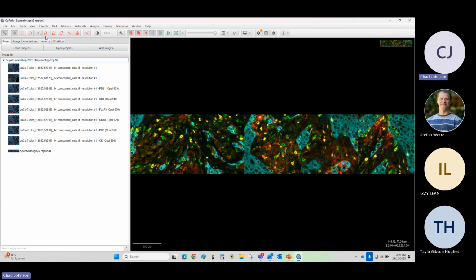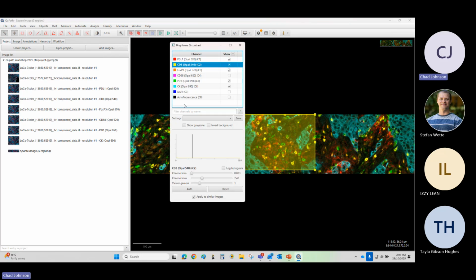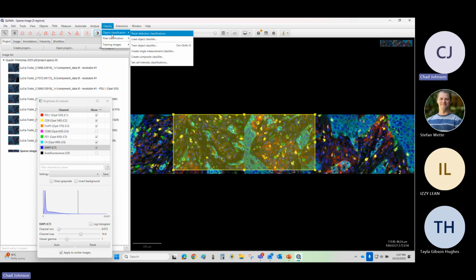And then again, what you would do is do what we did before and create a ROI. Of course, DAPI is there. It's just not showing up. And then do your cell detection. Oh, sorry. No, first of all, what you would do is you would create duplicate channels. So you create duplicate channels to propagate that out into separate channels for the algorithm.